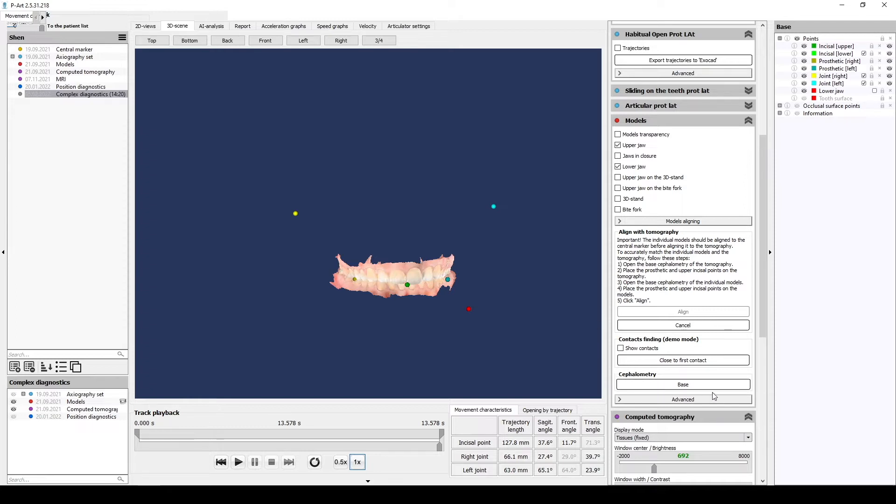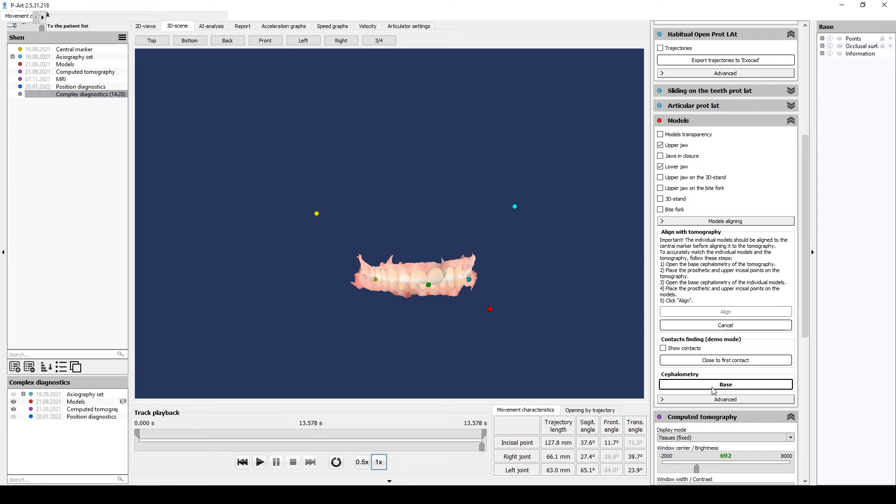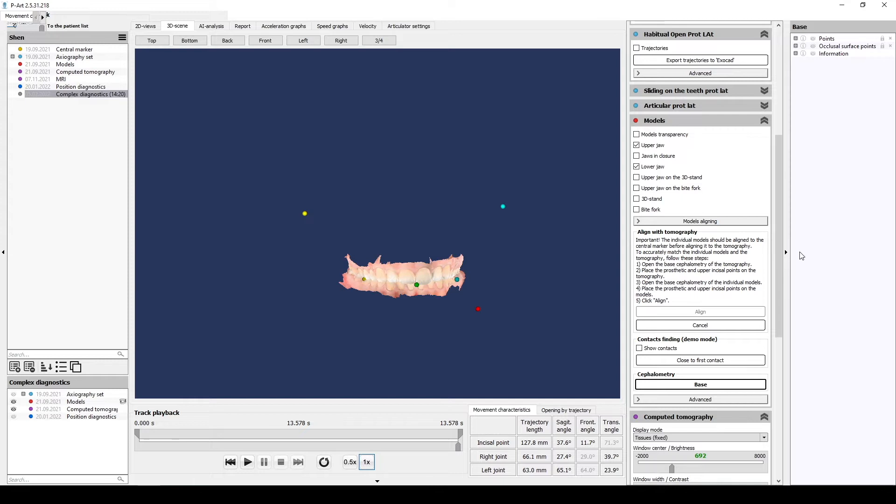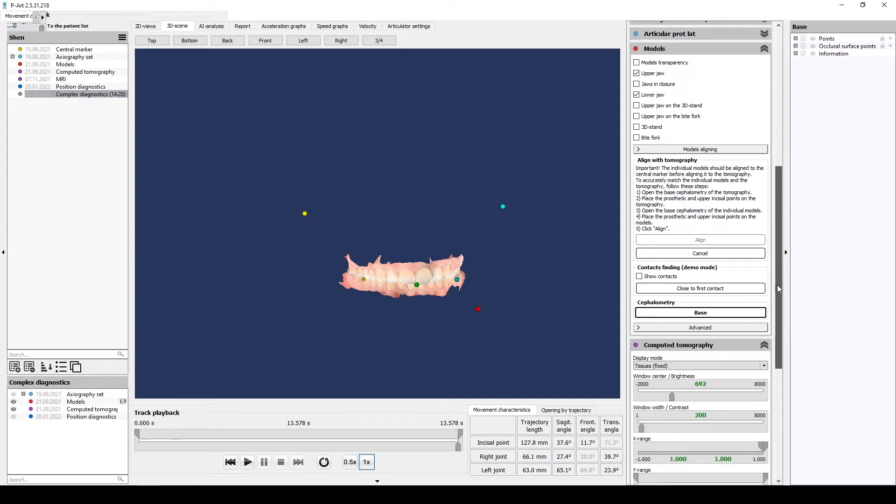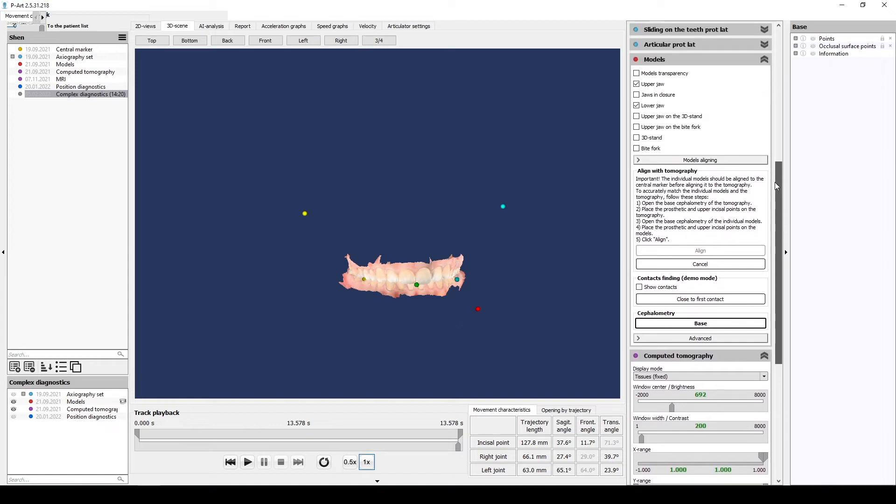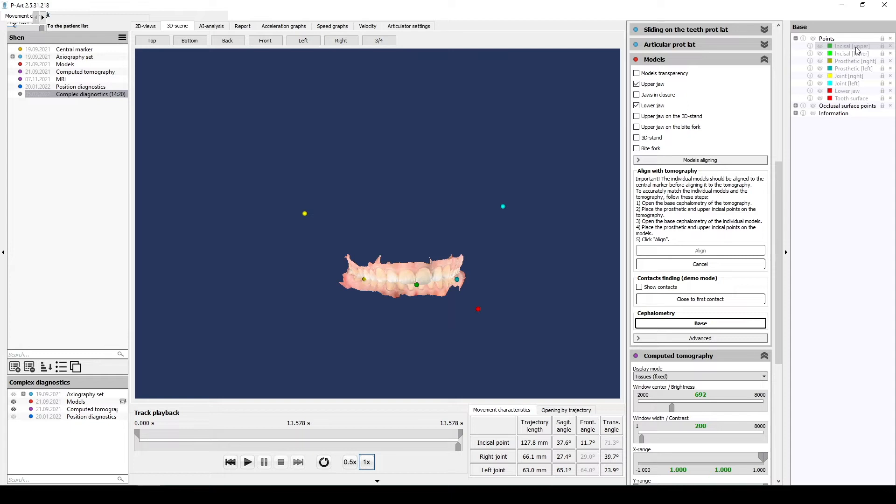Please be very attentive. In the program, we have two base cephalometry: one for tomography, one for models. Do not mix them. You can't take base CEPH from individual models and place them on CT. Now we are in the models section, and base CEPH is for models also.